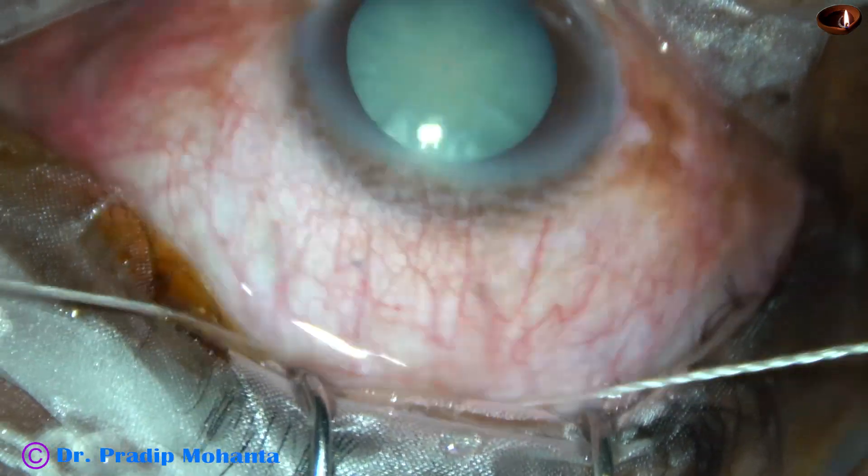This is a blind tunnel. The corneal end is closed; we are going to open it in a short time. Now capsulorhexis is to be done. Let us see the measurement of this wound — it is 8 mm.